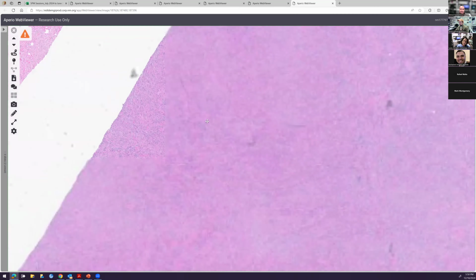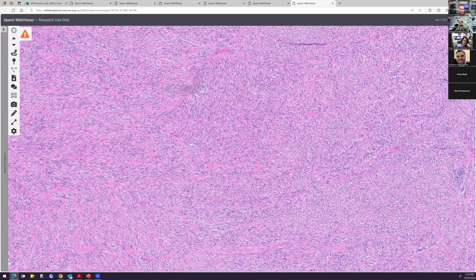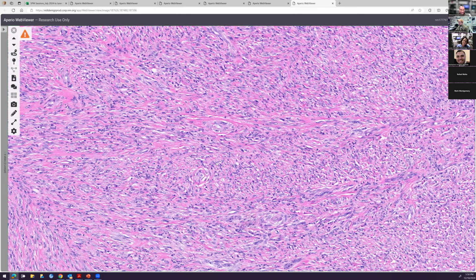And it just doesn't feel like this is going to be a sarcoma, right? This slide, on the other hand, kind of annoying, right? Yeah, that was so ugly. Much different. Well, ugly, sure. I don't know. It doesn't look that ugly. Don't be so mean. I just don't like the pattern, you know? Very cellular, right? Very cellular.